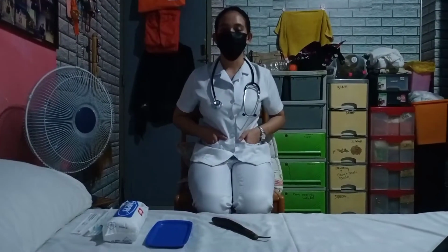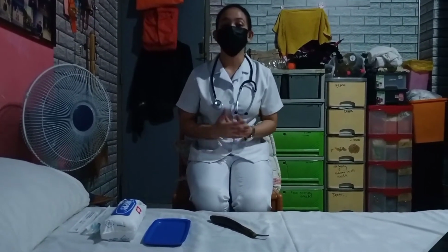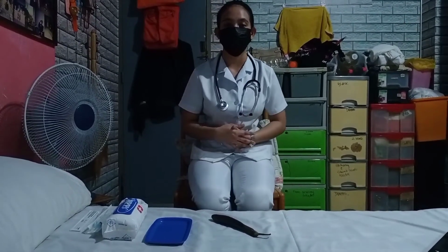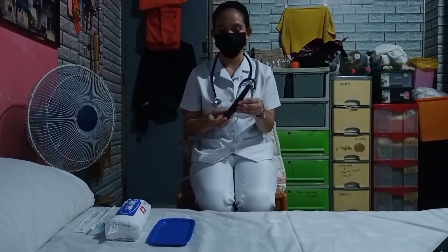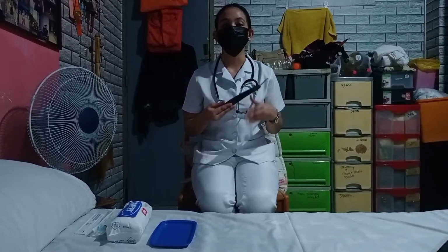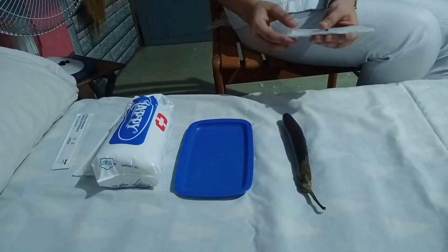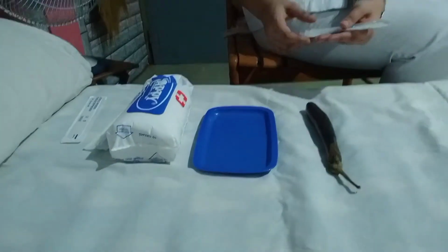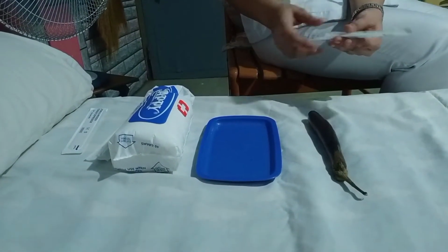Since we are in quarantine right now, I could not really inject a real patient, so we are required to perform the parenteral medication on an eggplant or a chicken breast. I chose the eggplant. The second step is to pick up a syringe and attach the aspirating needle to the syringe. I also place the syringe on the hypodermic tray, which is this.